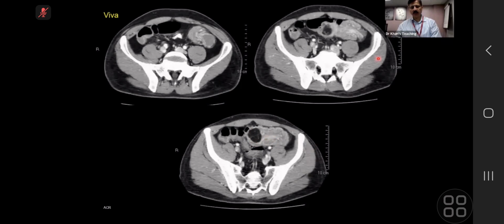So this lipoma is the leading tumor. If you see the mesentery going in, this is the lumen of the intussusceptum, and this is the intussuscipiens, and you can see that this lipoma is the lead point which has taken it inside. And in the exam, you will ask the examiner, I want to do my densitometry, and that will confirm that this is a lipoma.